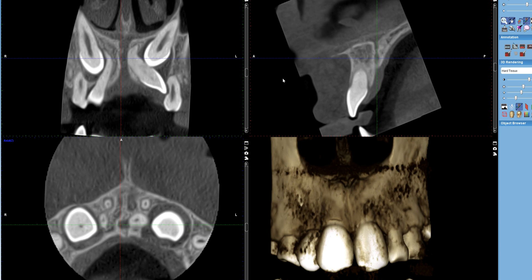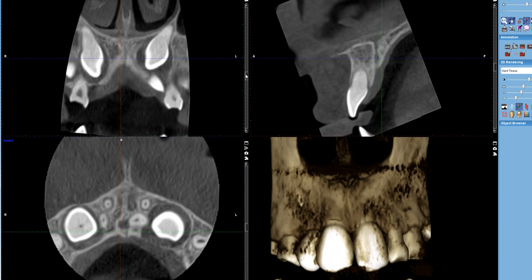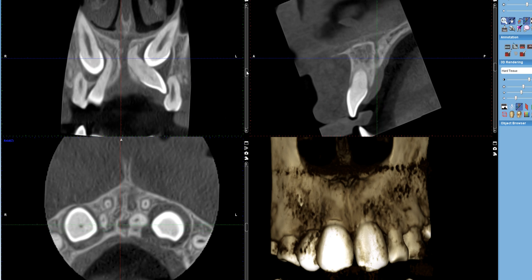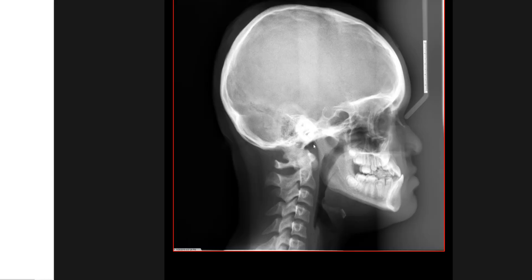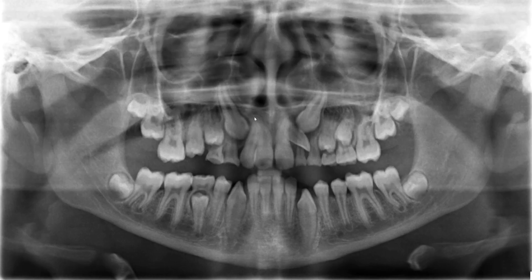This lateral incisor has clearly been shifted or displaced medially, almost to the intermaxillary suture. As a matter of fact, it actually engages the nasopalatine canal — the root is extended into the nasopalatine canal. You can see as this tooth is being displaced while trying to erupt into occlusion, there is quite significant dilaceration of the root. The precise extent and severity of the dilaceration of these two laterals could not have been easily detected on a panoramic radiograph.